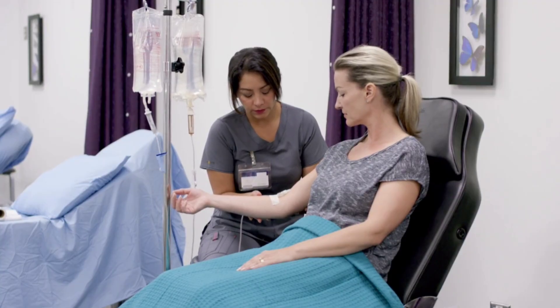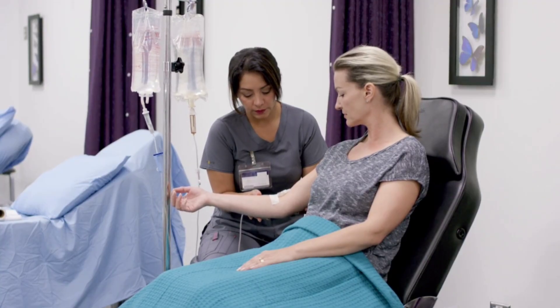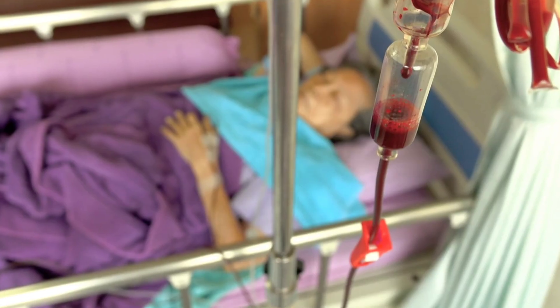Why IV insertion is important: it's used for fluids, medications, and blood products. Confidence in IV insertion reduces patient anxiety and improves care.